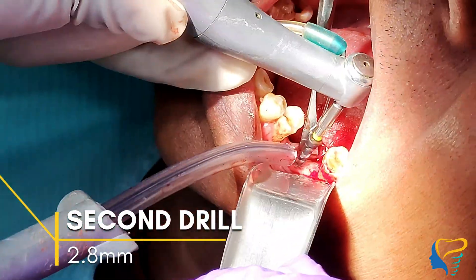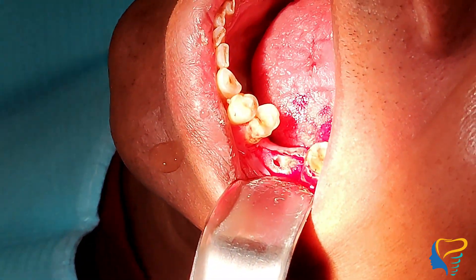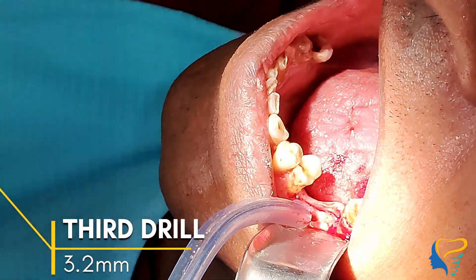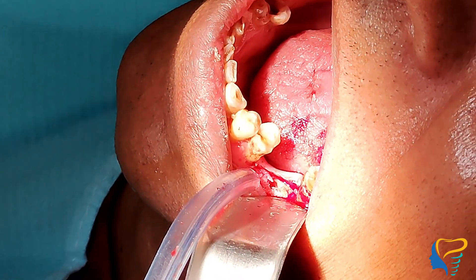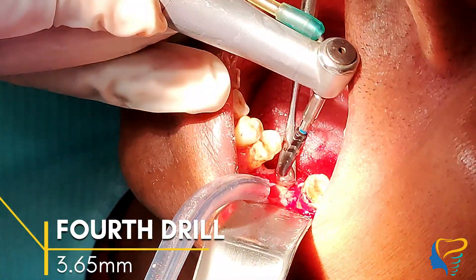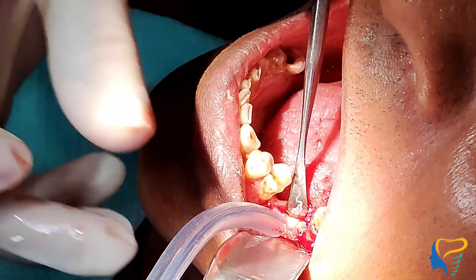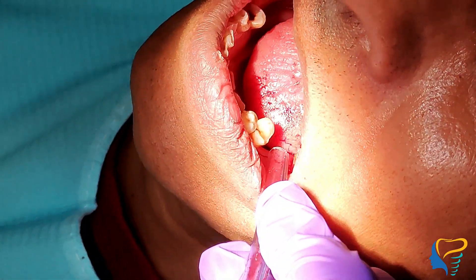Going ahead with the second drill of 2.8 mm. As you can see, these are the step drills — we don't drill till the apex. The second drill is shorter than the first, and this is the third drill. We have also completed the fourth drill of 3.65 mm for crestal preparation only, as the implant is tapered and we don't need to drill till the apex of the site.